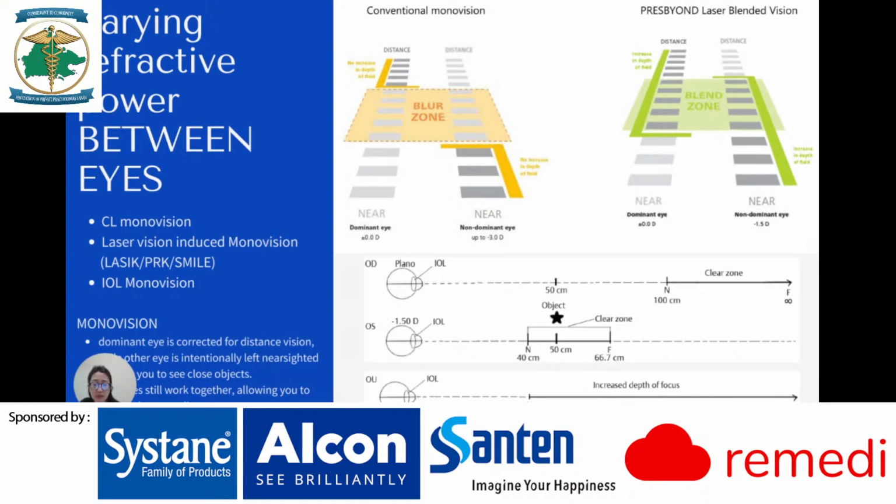There are various methods that can be employed to create monovision, such as contact lens monovision, monovision LASIK, PRK, or SMILE. You can also utilize intraocular lens monovision. The disadvantages of this method would be that although monovision is relatively easy to implement and works for many individuals, it might not be tolerated by some.